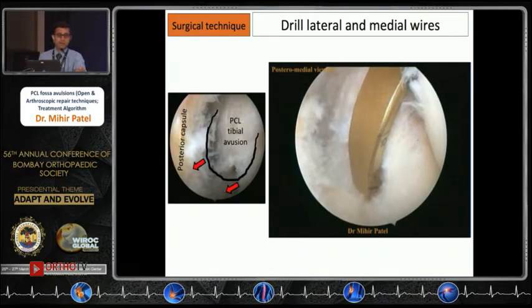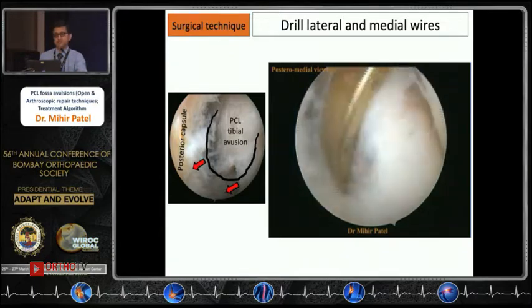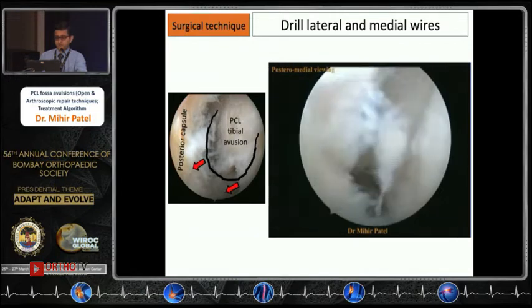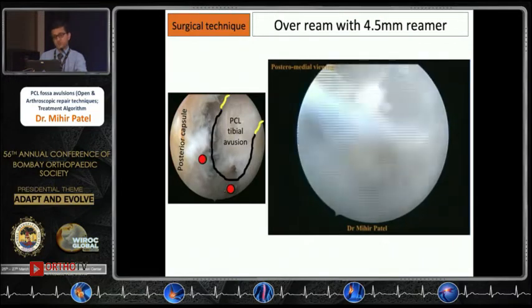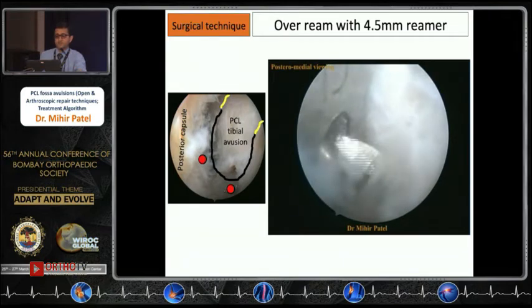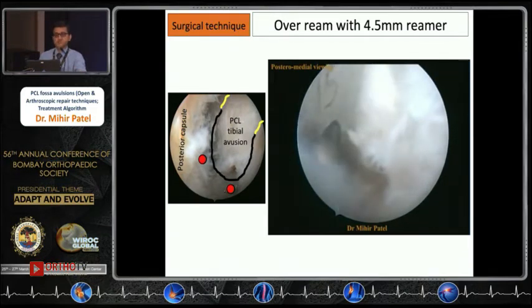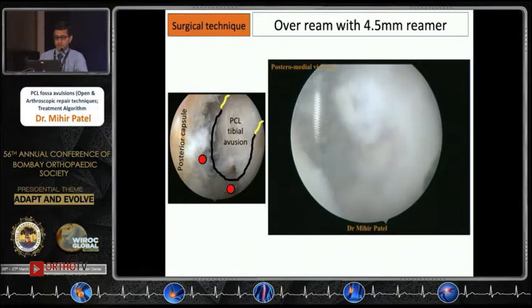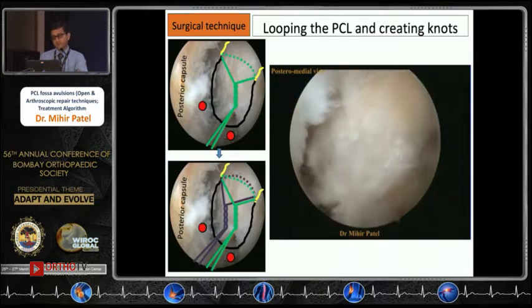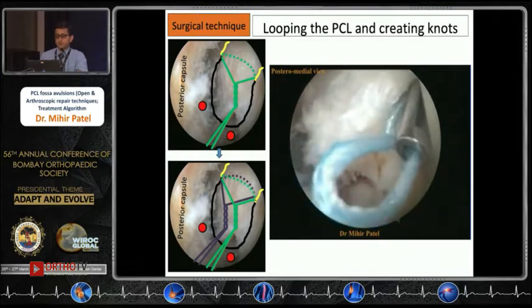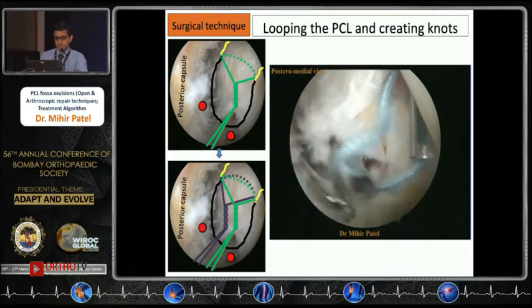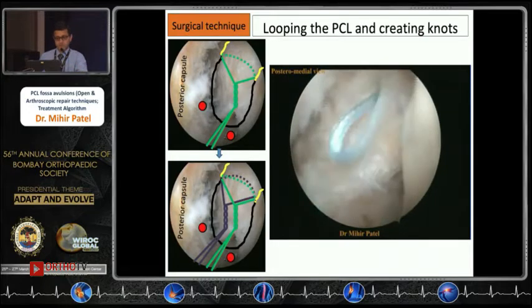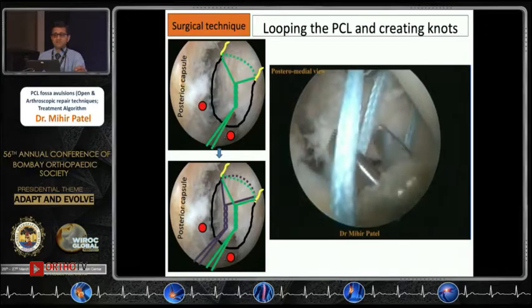The fracture crater is prepared using a burr and arthroscopic shaver, removing fibrous tissue especially in chronic cases. A PCL jig is used to drill two tunnels — lateral and medial in relation to the fracture crater — from the anteromedial tibial incision. These two wires are then over-reamed with an endoscopic reamer, protecting the wires from progressing posteriorly, making this procedure very safe from posterior neurovascular injury. A number-two FiberWire loaded on an arthroscopic knot pusher is looped around the PCL at its ligament-bone junction.